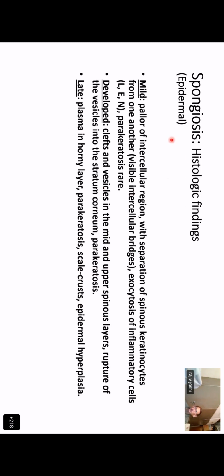So histologically, yeah, any questions? So that same question, there was one: if there are intraepidermal vesicles containing neutrophils, how do we differentiate pustule and pemphigus? If we are going to cover it in the subsequent cases, then maybe we can. Some slides afterwards, we'll talk about it later. Okay, okay, sir.